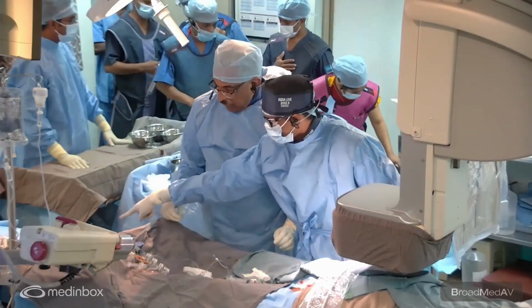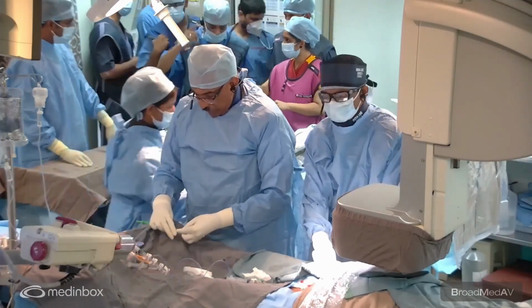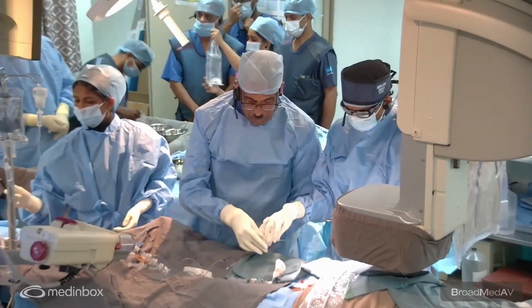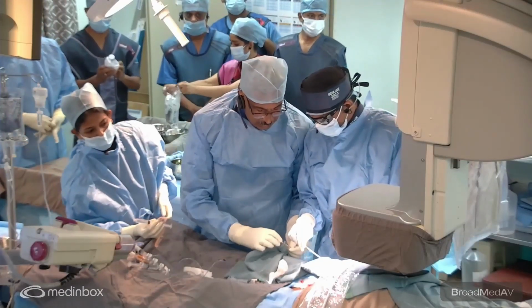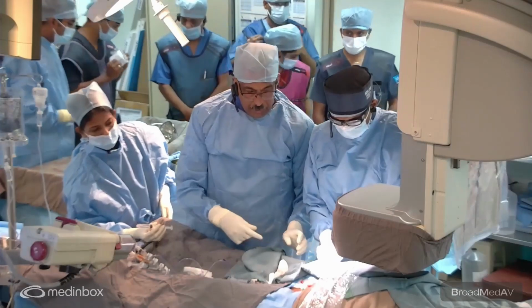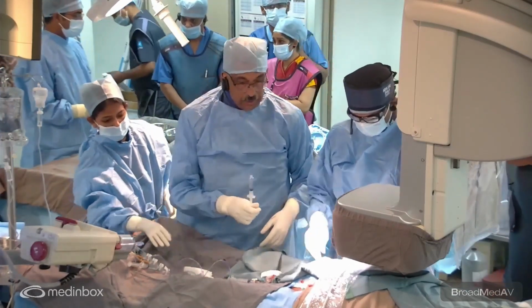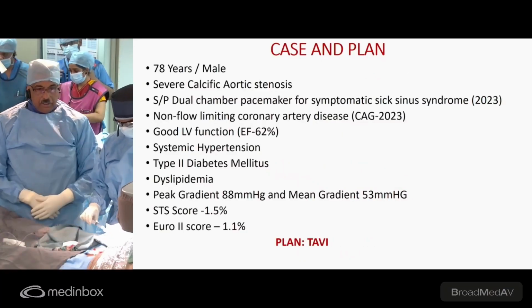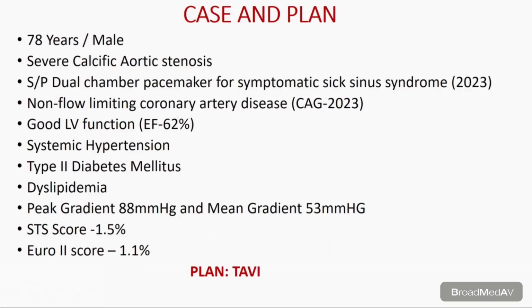This is with me, Dr. Nandakumar, who's going to work with me with an interesting case. Before we go into the case, I want to introduce my colleague, Dr. Ashish, who will join me here. And we have nursing staff, Prabhu, the technician, and all the others here to help us with this case. So can we go to the first slide, and Dr. Nandakumar will explain to you what is the history of this patient. So Dr. Nandakumar, please go ahead and give us the case history.